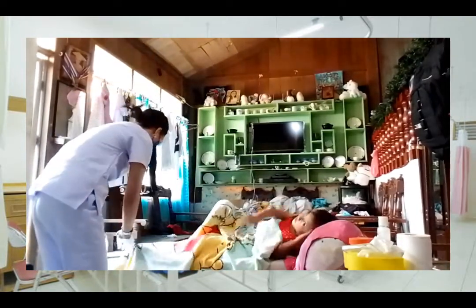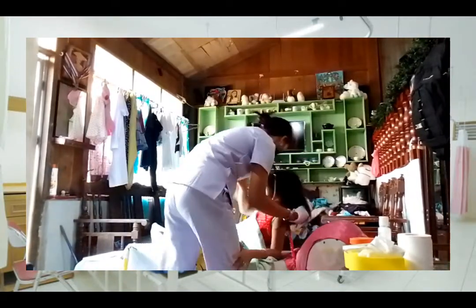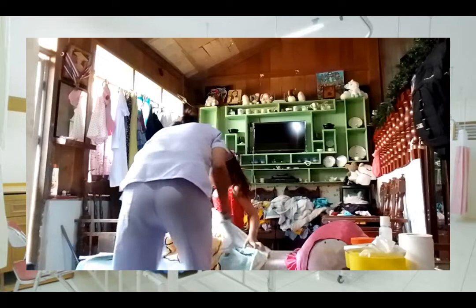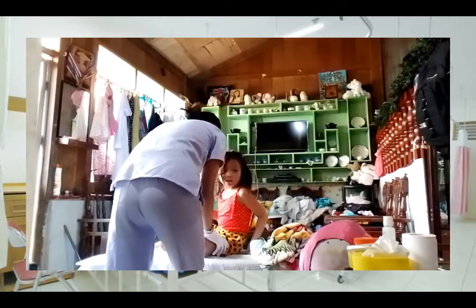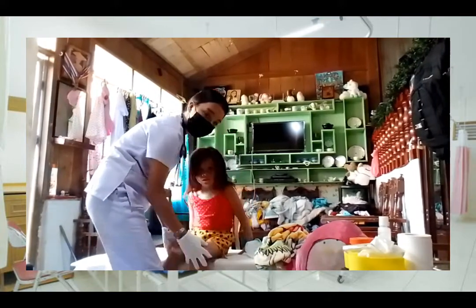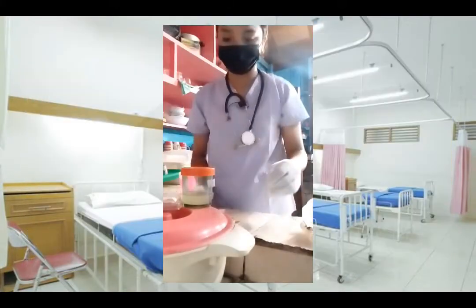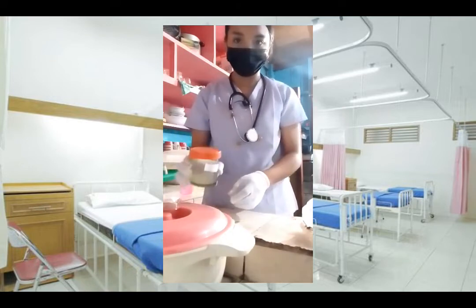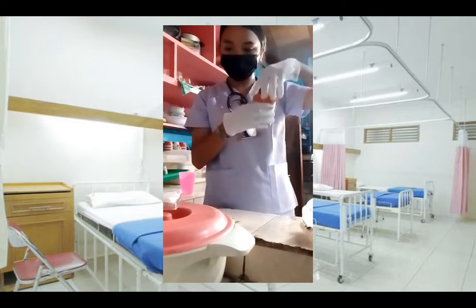Remove the bedpan after the defecation and cover it. Help the client in cleaning the perineum. Take the covered bedpan to the utility room. Obtain a small portion of fecal material. Place it carefully in the specimen container. Clean the bedpan, remove gloves and wash hands. Send the specimen to the laboratory immediately.